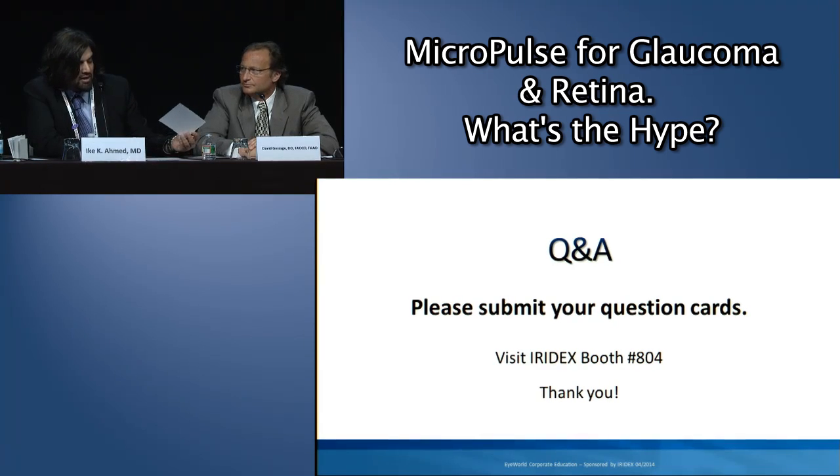Pigmentary glaucoma, we don't have a problem, as I said. We use 360. Steroid response, for sure. I think it can definitely be used, and we do this as a temporizing measure. Neovascular glaucoma, however, I would not suggest using laser trabeculoplasty with, as well as angle recession. I think the mechanism is unlikely to be effective on that. So those are my quick answers as far as that.